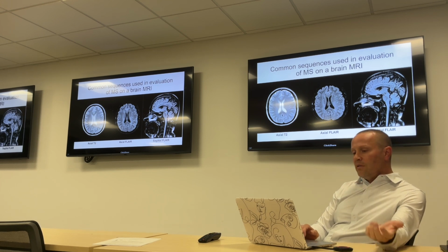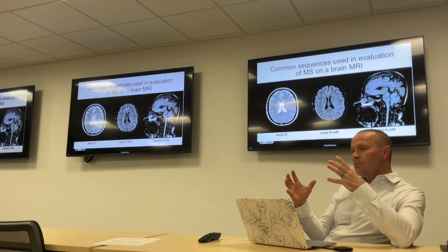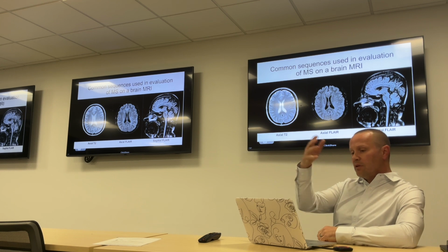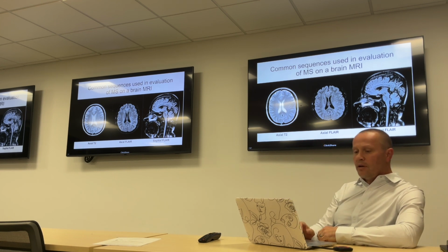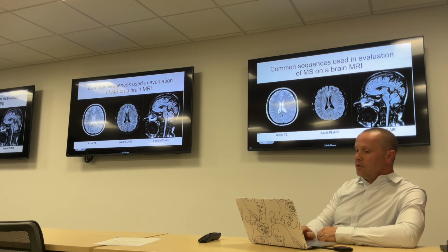The way we learned it, on your first day of radiology, the mnemonic is World War II: water is white on T2. In this case the water is actually CSF, cerebrospinal fluid. It fills your ventricles and bathes the outside of your brain. It cushions the brain, it allows nutrients to wash around, and it allows pollutants to wash out. This is the same fluid that communicates down into your spine. When you get a lumbar puncture, you're accessing this same fluid.